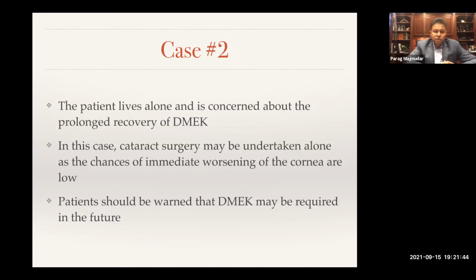I think that the chance of me making your cornea worse immediately is pretty low. I mean, I've done a lot of DMEKs. I've done a lot of cataract surgery over the years now, and I feel pretty comfortable that, unless there are some unforeseen situations, I can end up with a patient who has really low impact on their endothelial cells, especially when they're already starting off with very mild changes like 548 and pretty good healthy endothelial cell reserve, as you saw. And so I tell them that, look, you may need DMEK in the future. We'll keep monitoring this. And if we get past the first few weeks or month and the cornea does well, then I think the cornea is not going to be an immediate concern.